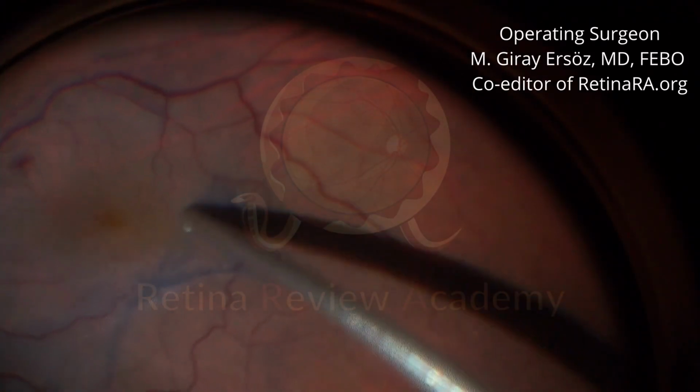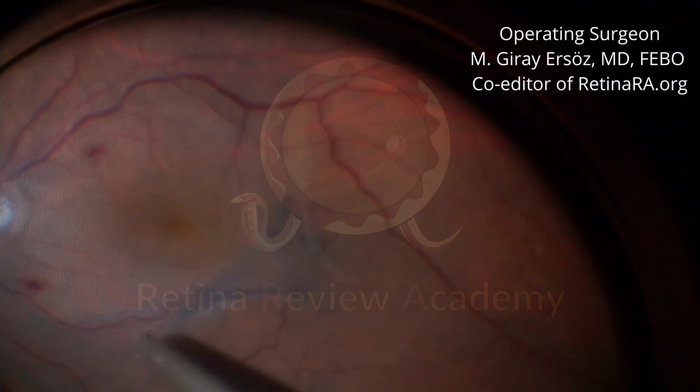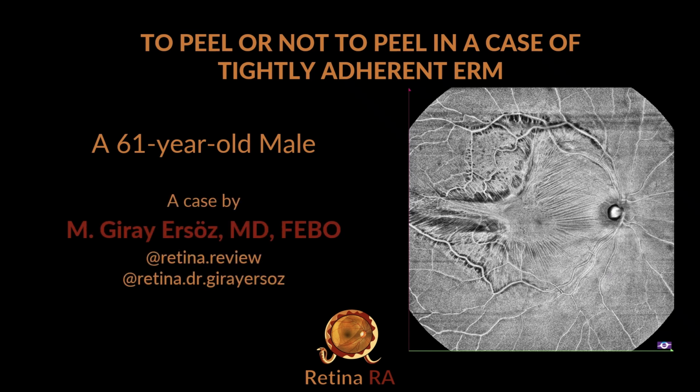This video will present a case of a tightly adhered epiretinal membrane and pre-existing retinal damage. Which would you prefer, peeling or not peeling? I am Dr. Jirey Ersoz, the co-editor of RetinaRA.org, and this case is from my archive.